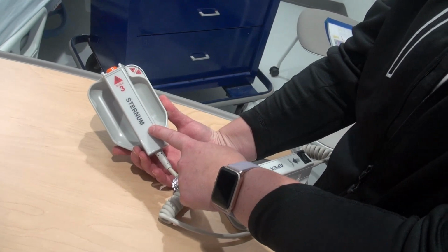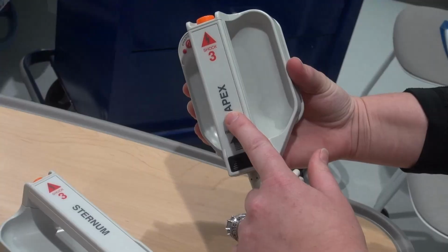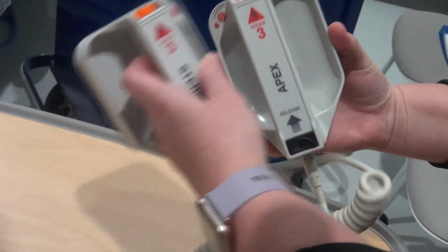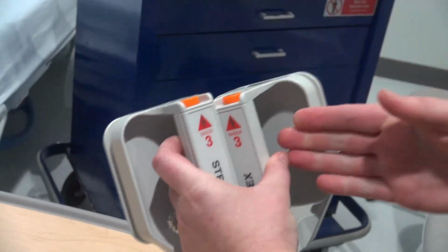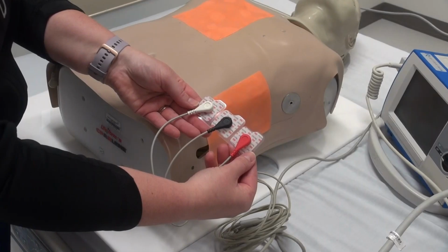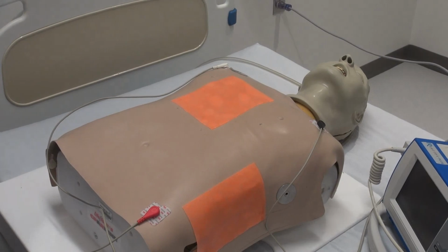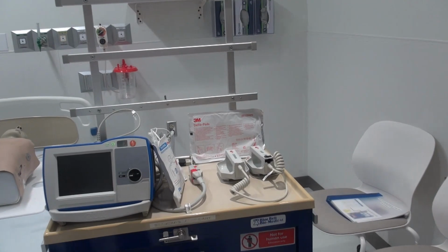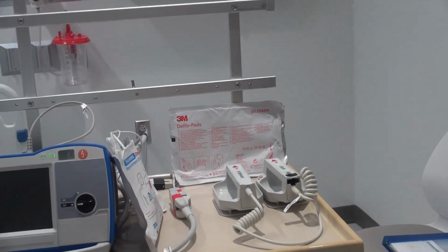The sternum paddle has an energy select button that can be used to adjust the joules. The apex paddle has a charge button. Both paddles have discharge buttons that must be pressed to deliver energy for defibrillation or synchronized cardioversion. When using the paddles to perform a synchronized cardioversion, the ECG leads from Zoll must also be applied to the patient. To defibrillate, first obtain the crash cart, paddles, and gel pads from their designated storage location in your area.